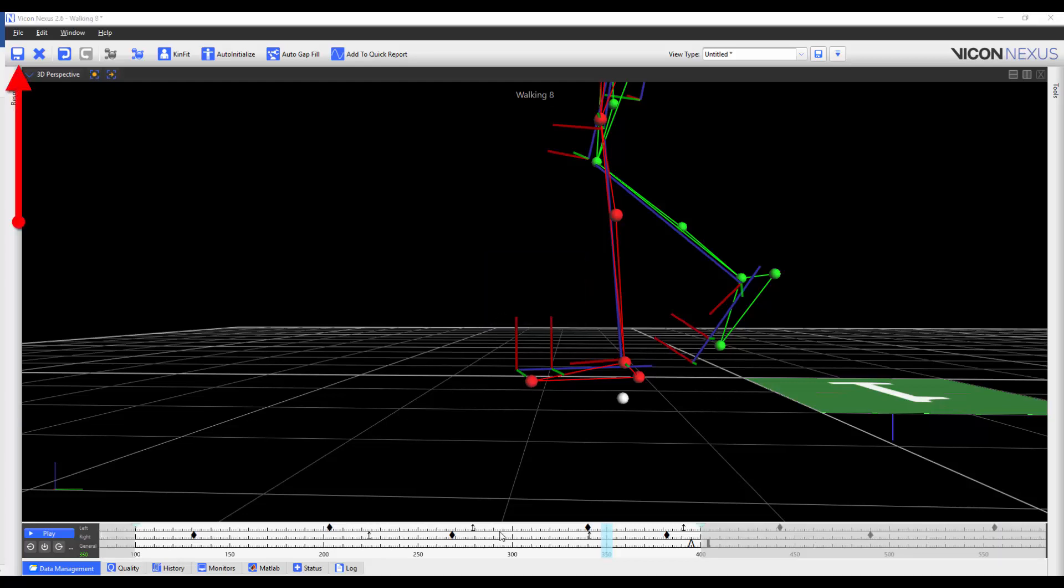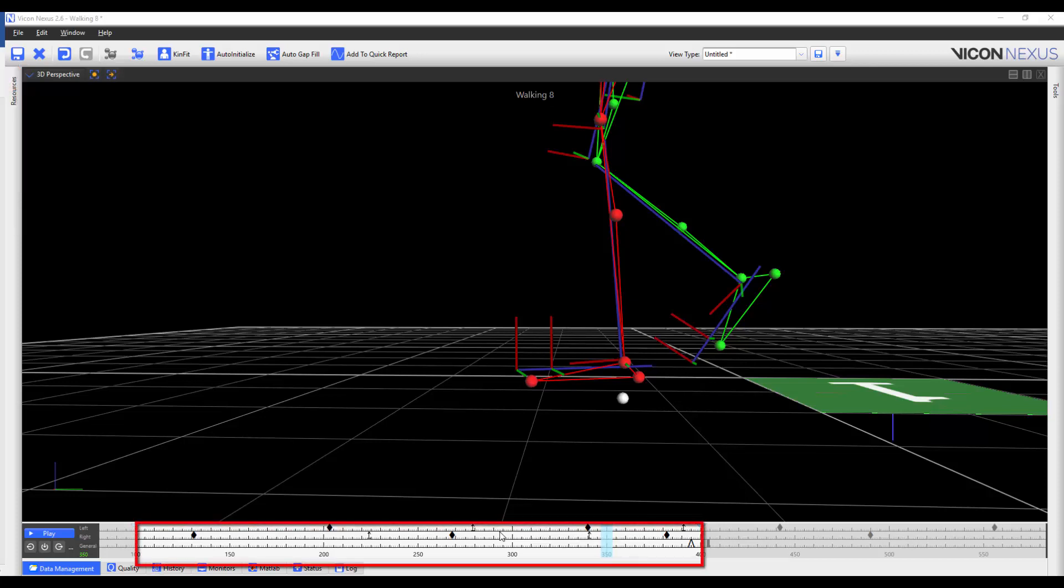Once you save the trial after you have set the region of interest, you are cropping your trial to that region of interest.